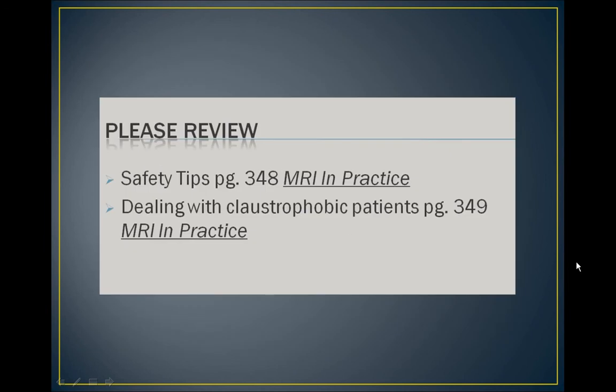This concludes the presentation on MRI screening and safety. Make sure to review the importance of patient and personnel screening, know the contraindications for MRI, and the precautions taken with certain implants or devices. Review biologic effects of the magnetic field on patients. Know that there are emergency procedures in place and what to do if a code, fire, or quench were to happen. Understand that the magnetic field reaches far beyond the magnet itself, and that there are potential risks with patients that have pacemakers and other ferrous implants. Review the effects of acoustic noise on the exam and the patient, and how claustrophobia can be alleviated.